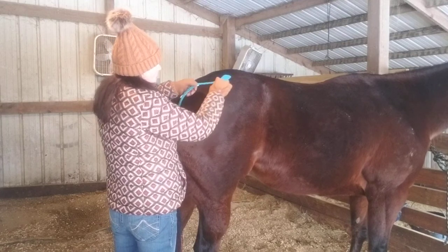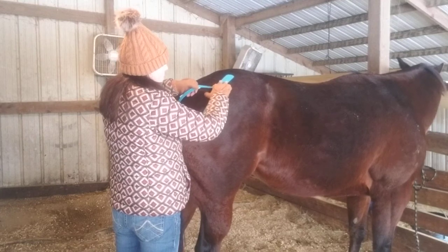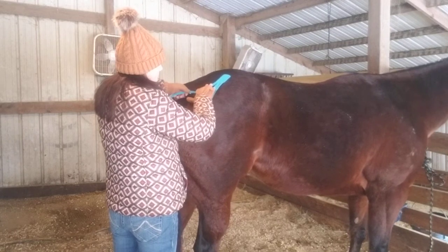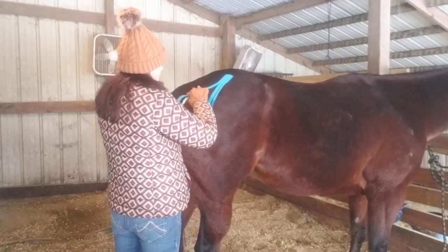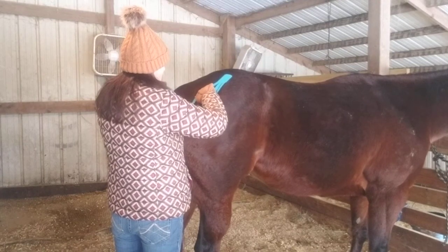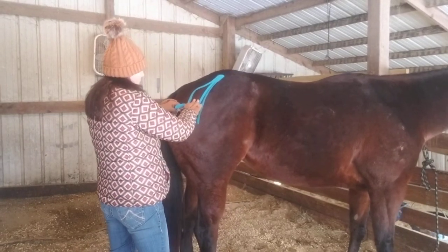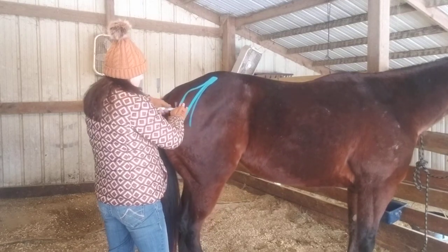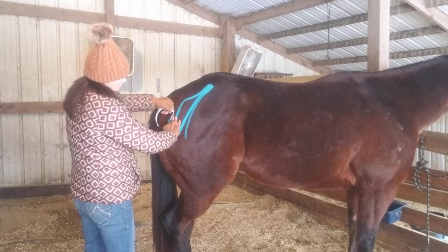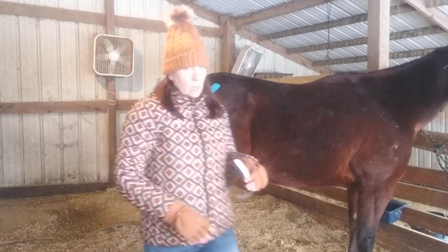With this application I'm going to do a little bit of stretch in a straight area, and then no stretch and round stretch, stretch, no stretch, and round stretch, no stretch, and round and round, stretch again, and then lay the last bit backing it into the area.